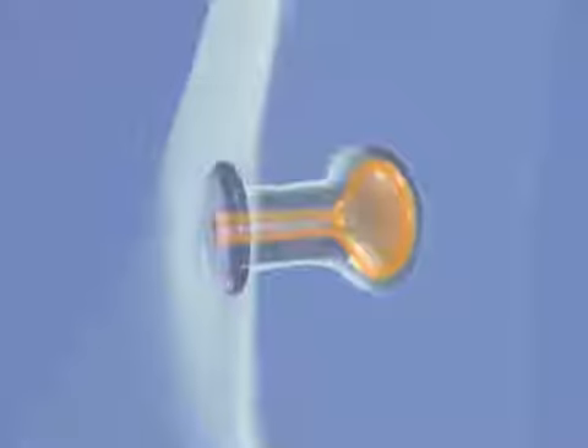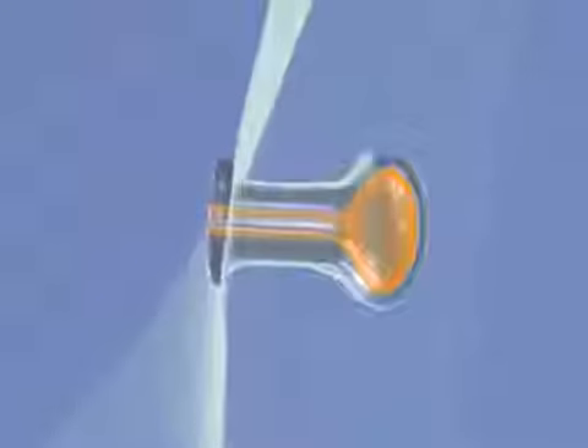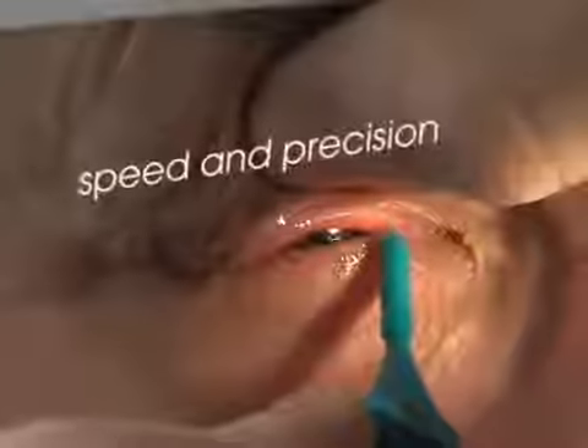A blind hole through its center is used during insertion. The profile of the painless plug allows the practitioner to adopt the optimal angle while positioning the plug easily and accurately in the patient's punctum.